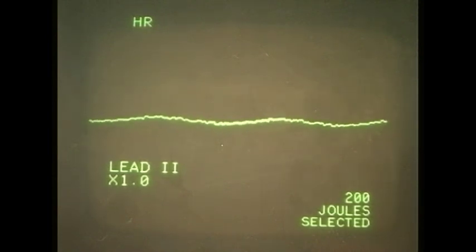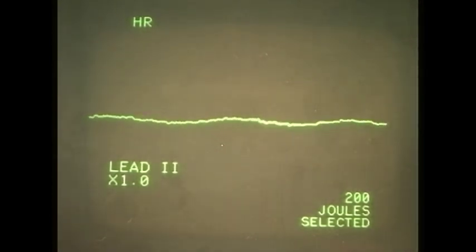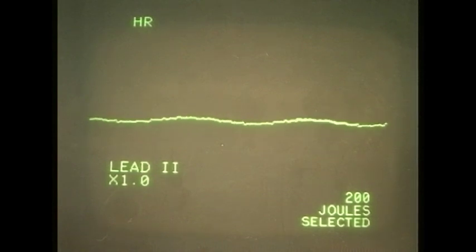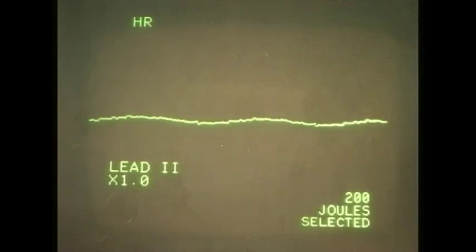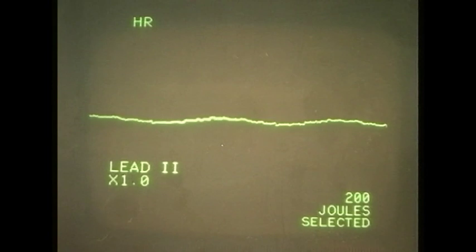I think that's a golden rule. Any time you're using any equipment of this nature, it's a guide. You've always got to look in your patient's face, check the patient's pulses. We always say treat the patient, not the monitor. Absolutely. But this obviously looks like an asystole. The other thing that we would need to rule out is a very fine VF because obviously the management would be slightly different.